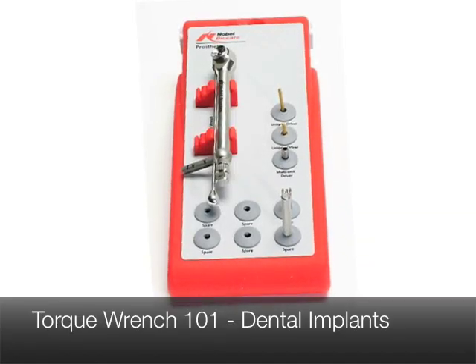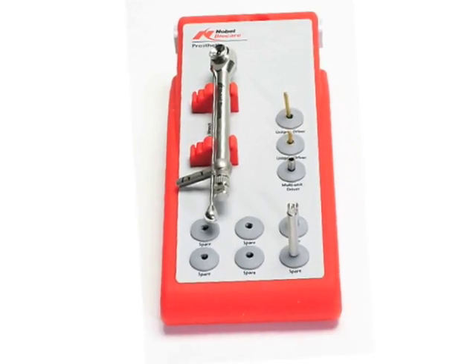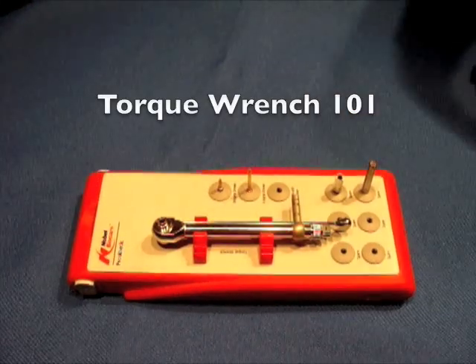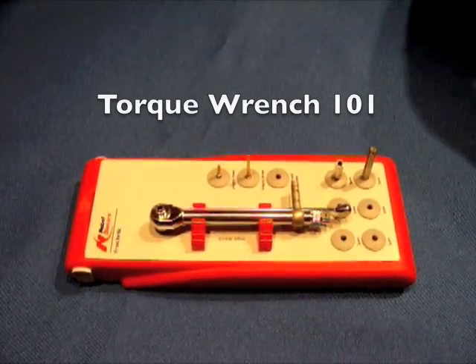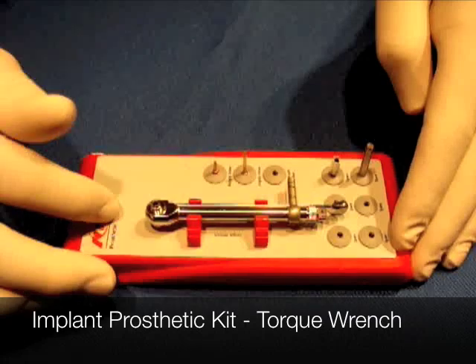Hello, this is Dr. Scott McLean and this is a YouTube video about Torque Wrench 101, replacing dental implant crowns. One of the things you really need to know in prosthetic implant dentistry is how to use the torque wrench. The torque wrench comes as part of the prosthetic kit, as you can see here.